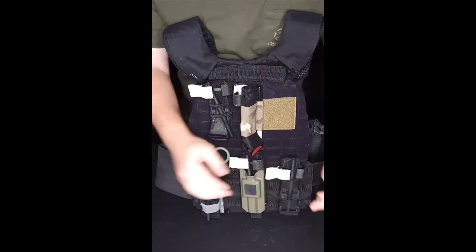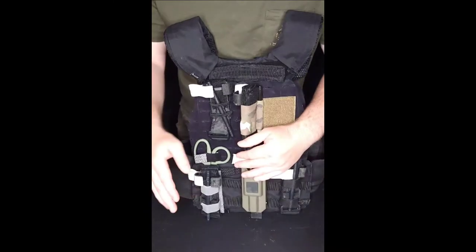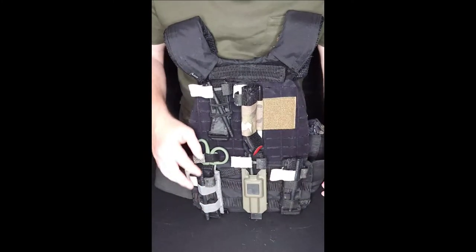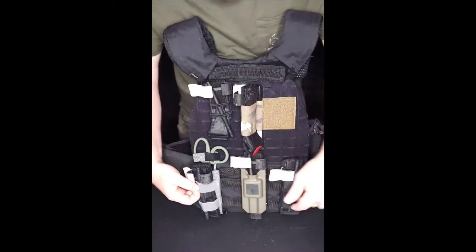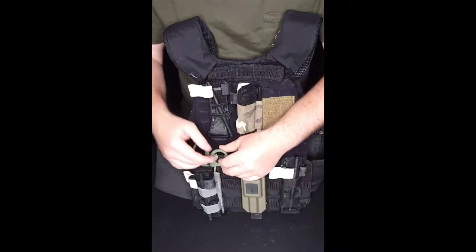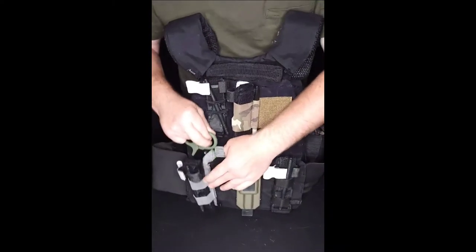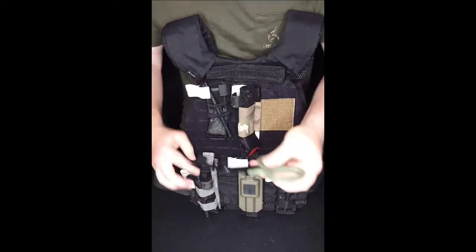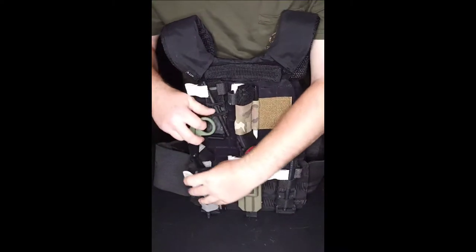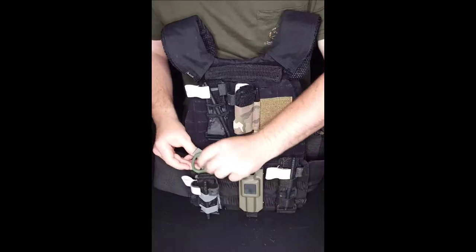Then we have this one — also $6.50 off AliExpress. Basically the same thing, it's got elastic, but this one features a slot for trauma shears so you can tuck them in the back. It comes with a normal flap to keep it in place, and the connection is a proper MOLLE weave.